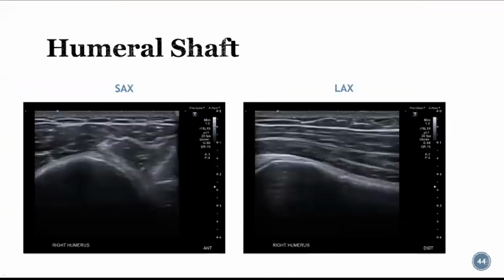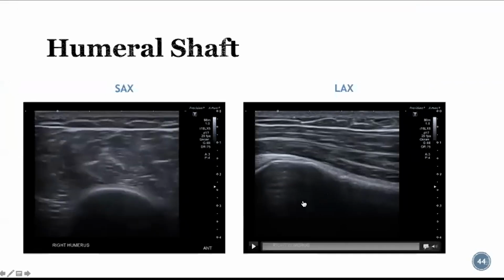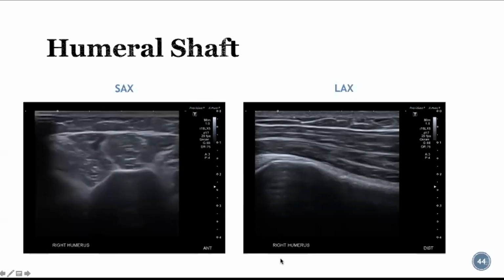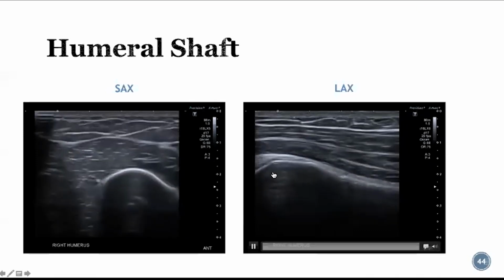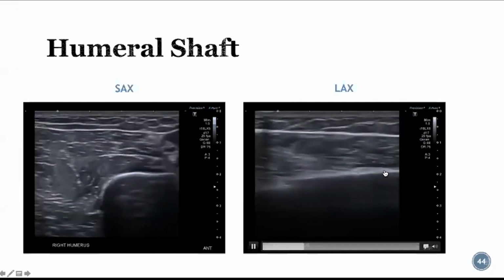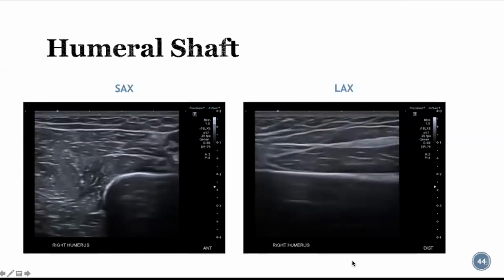And the other things that can mimic fractures and rotator cuff tears, and that you'd want to rule out in the setting of a dislocation, would be a humeral shaft fracture. And again, this is going to be similar to when we're evaluating the clavicle, where you want to look at the cortex in both short and long axis. I think the long axis view is the most telling, but this is just me scanning from proximal to distal over a normal humerus. And then the same thing here in long axis, we're going from proximal and scanning distally, evaluating the cortex and looking for any areas of cortical irregularity or large hematoma, which we don't see here.